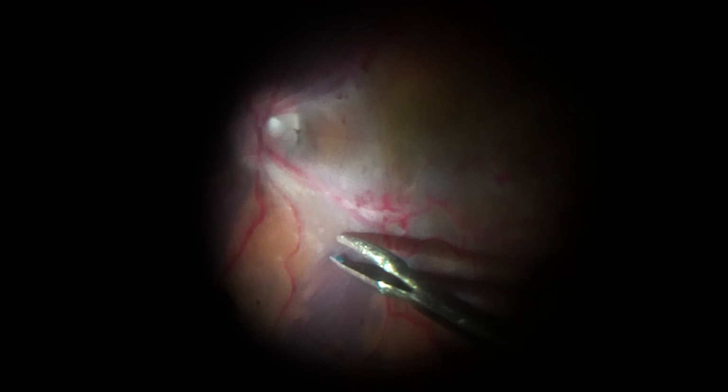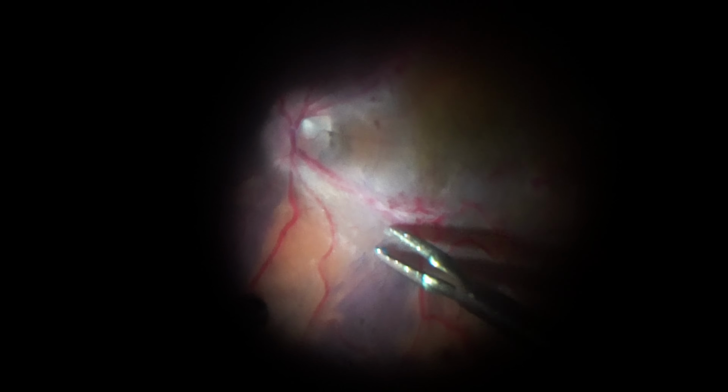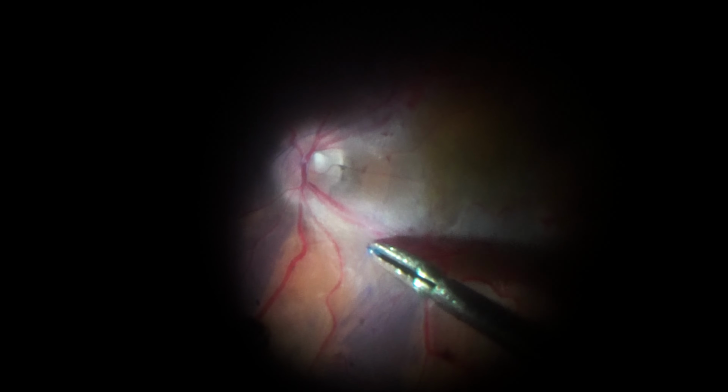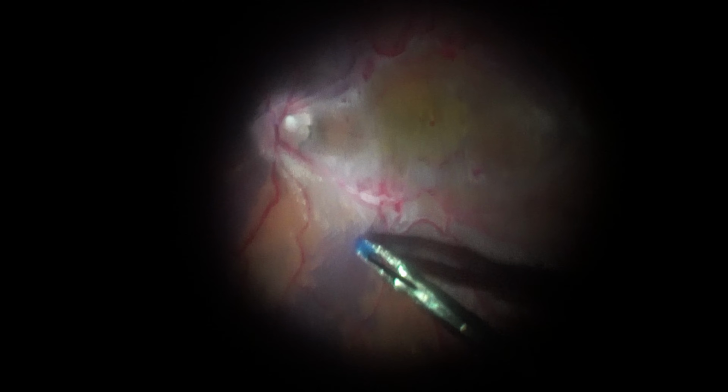Shaving the macular surface is not an easy task, as appropriate and controlled force is applied as a scrape-away-like movement, very gentle, and aiming to remove remnants of attached tissues both from vitreous and together with the ILM basal membrane of Müller cells.